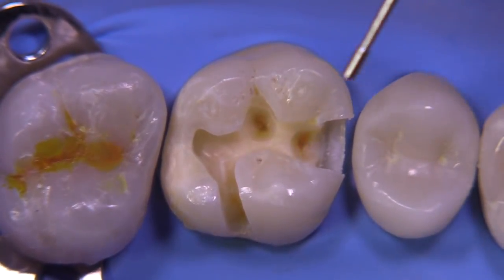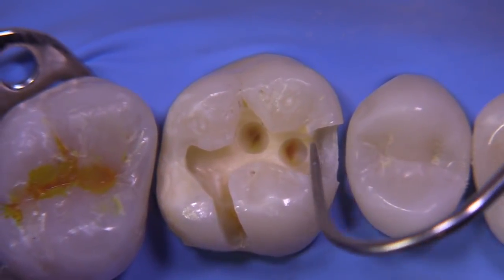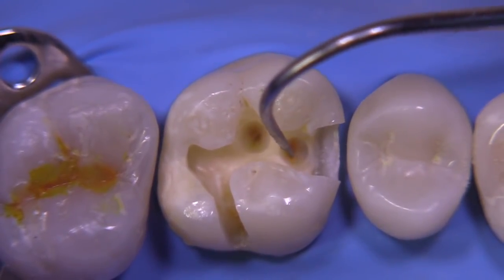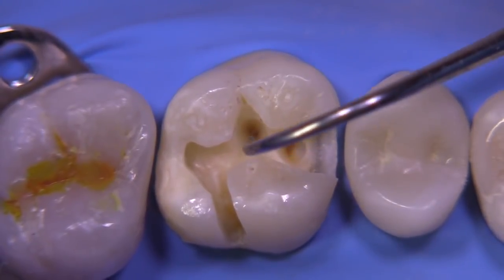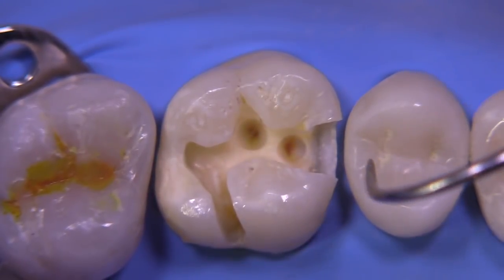It's important to look at the radiograph and make sure this doesn't have a large pulp horn. At this point the caries is hard and it's easily arrested with the appropriate restorative procedures.